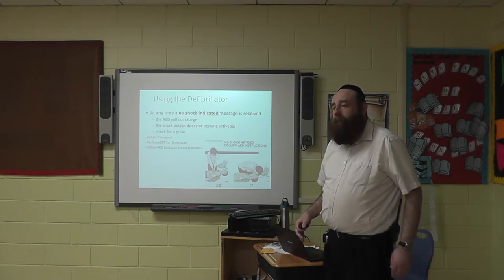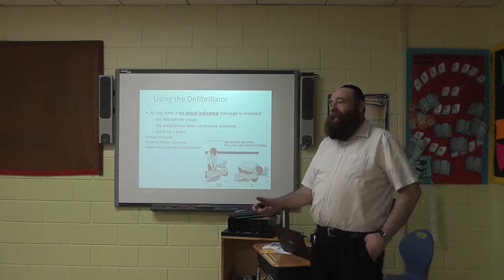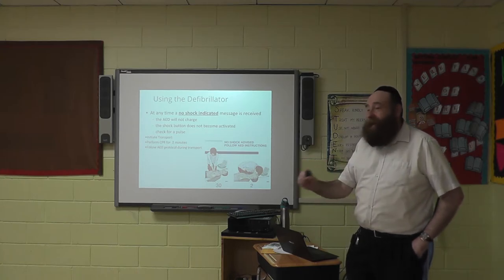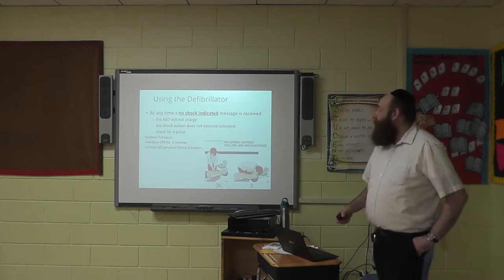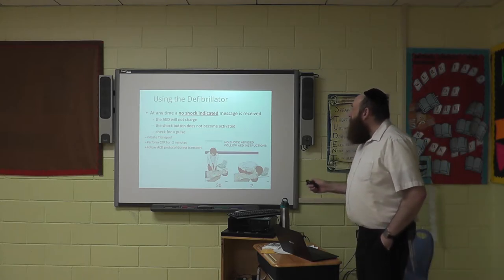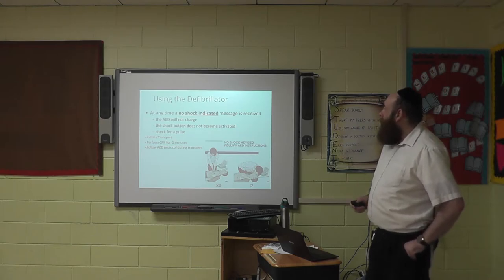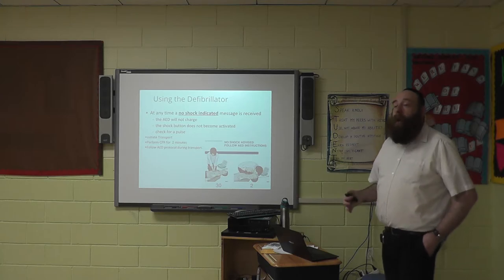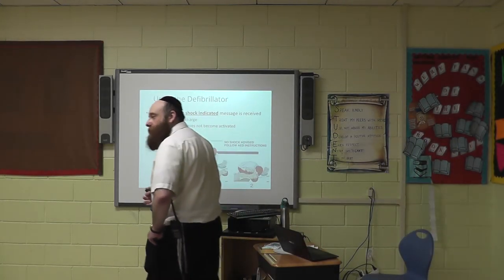How long after you finish shocking do you restart CPR? Immediately? There's no residual electric. Immediately. The second you take your finger off, it's resume. Okay, resume CPR. You're allowed to shock, I think, twice on scene, and then you have to initiate transport. If you get a no shock advised, you need to initiate transport.